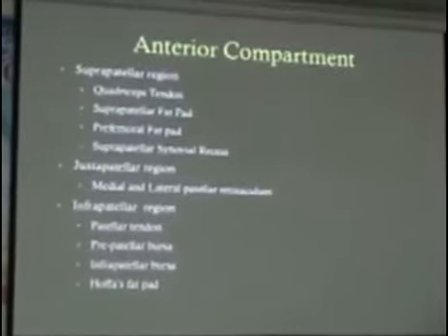So in the anterior compartment, we're looking at the suprapatellar region, the juxtapatellar region, and also the infrapatellar region.